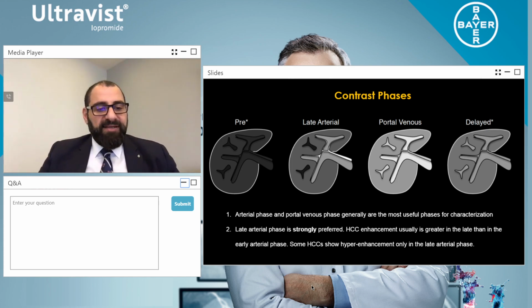Now, we have an excellent question from Lorraine Hood, which I know very well from Australia. Can you explain why 18-gauge cannula is preferred than 20-gauge? And given it takes 5 mils a second, the 20-gauge. Fantastic question. Lorraine, you're absolutely 100% correct. I mean, we would like to strive for 18-gauge for all contrast media injections, but 20-gauge is absolutely acceptable. Definitely it is. And thank you for that.